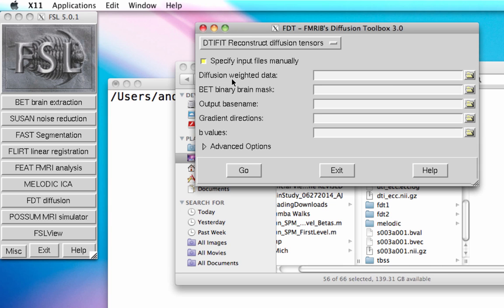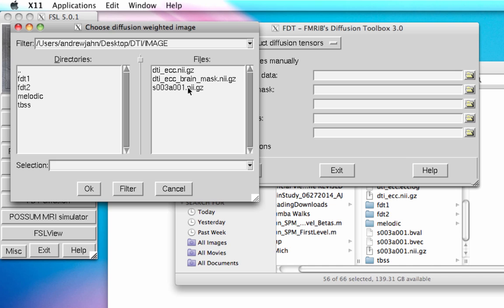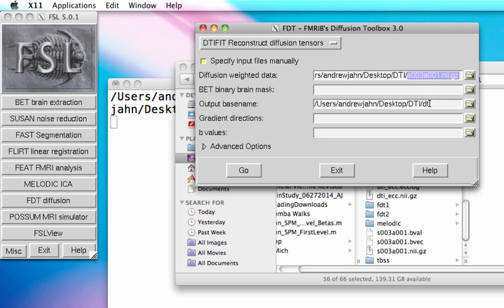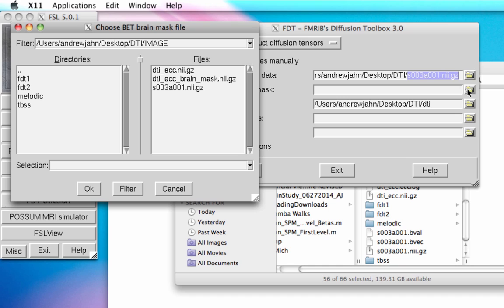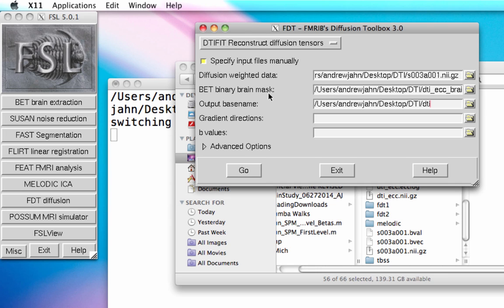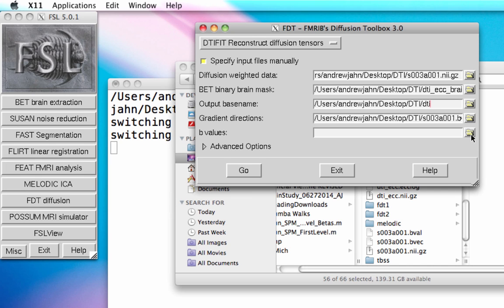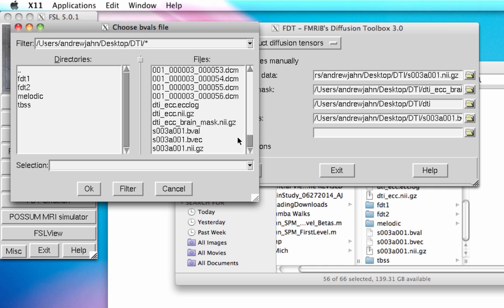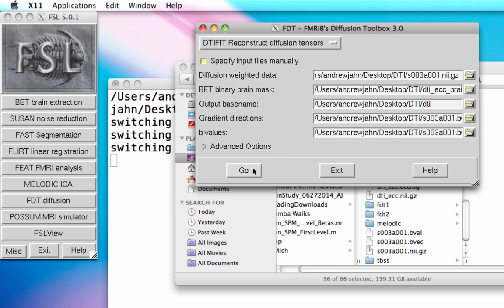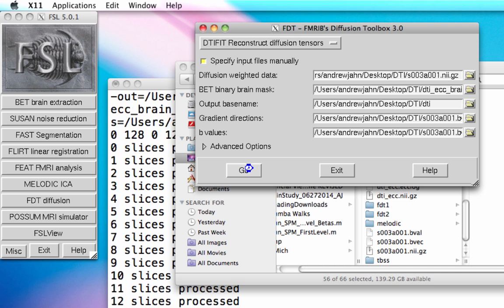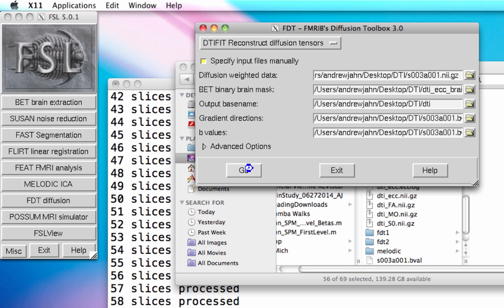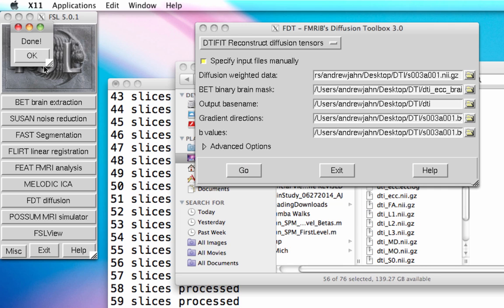For DTI fit, I click 'specify input files manually' and select the diffusion weighted data — the output from the conversion tool. It automatically fills in the output base name. I also created a brain mask, just like what we do through BET; there are other tutorials on that if you have questions. It also wants the bvec file and the bval file, both easily provided through the DICOM to NIfTI conversion. Once you hit go, it processes every slice fairly quickly.